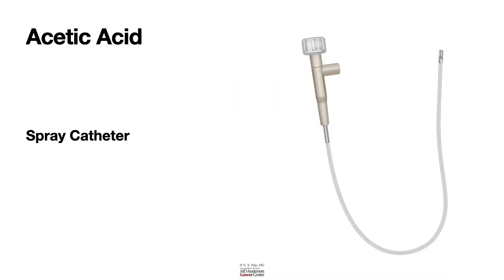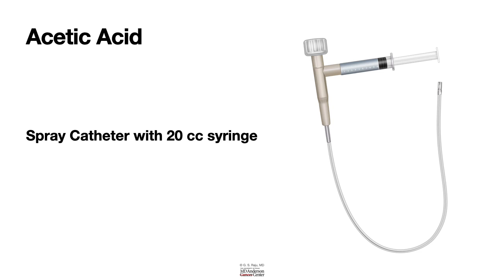You take a spray catheter and use a 20 cc syringe filled with acetic acid, and you use the spray catheter to spray.